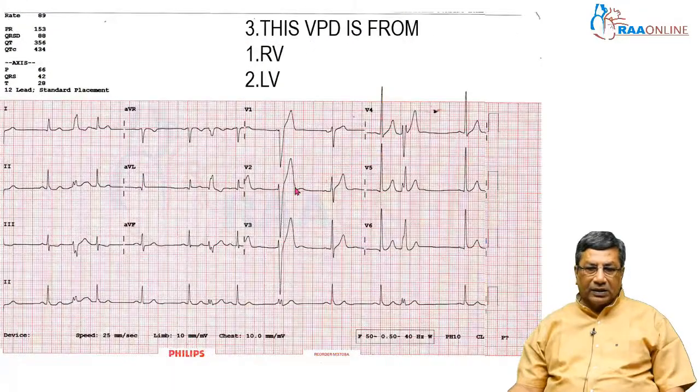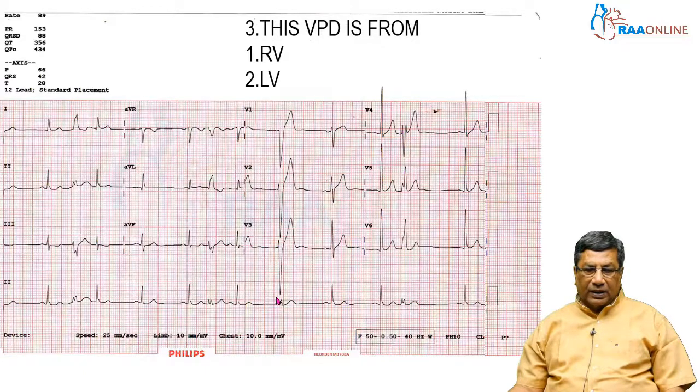Now, you can see the ECG, and we are asking — this is a VPD. This is definitely a ventricular premature beat.